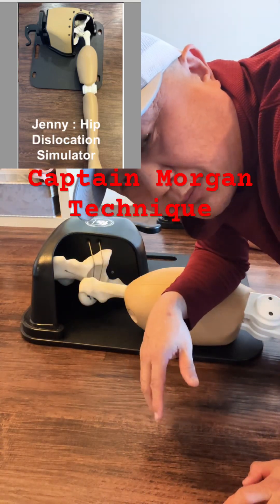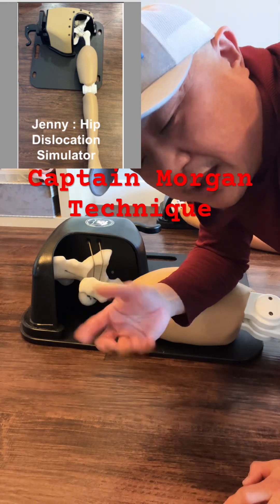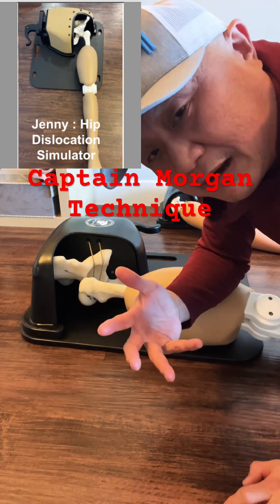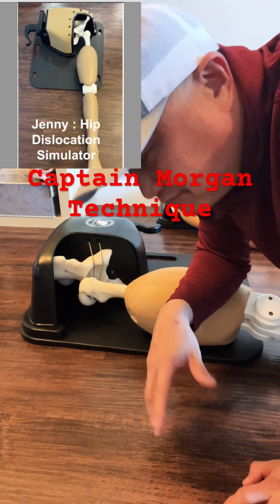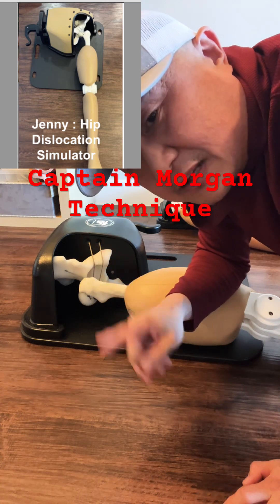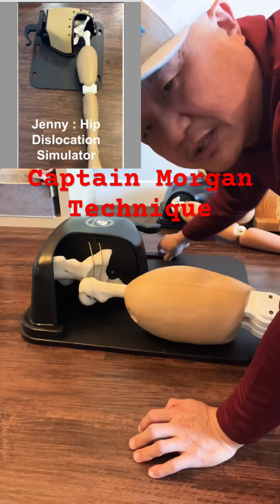You're at the emergency room as an ER resident — posterior hip dislocation. The patient comes in from a car accident, and as you saw, you may only have one resident available to practice. This is the hip dislocation simulator.